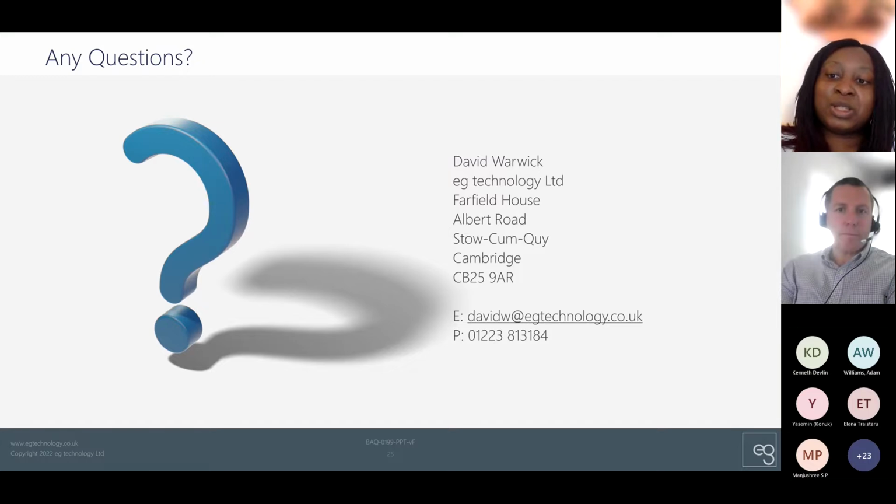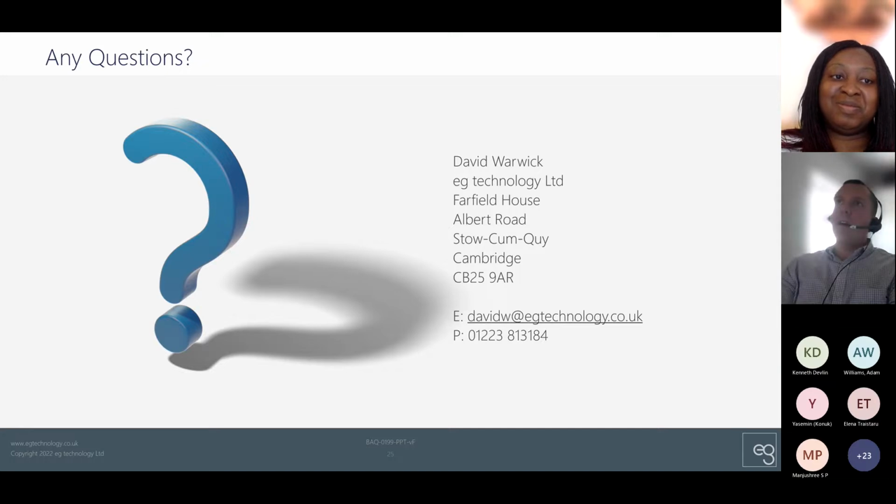Okay, great. Next question: what does regulatory strategy work involve? I think that sounds like a question about the broader approach to your device development. So you do want to think about your regulatory strategy quite early on in the product development process. The software standards are just one of many that could apply to your device, particularly anything with software integrated into it tends to have some electronics associated with it, and there's a whole electrical safety standard associated that you have to meet. That one's pretty weighty. That's something like 600 pages long, so it's quite a big one.